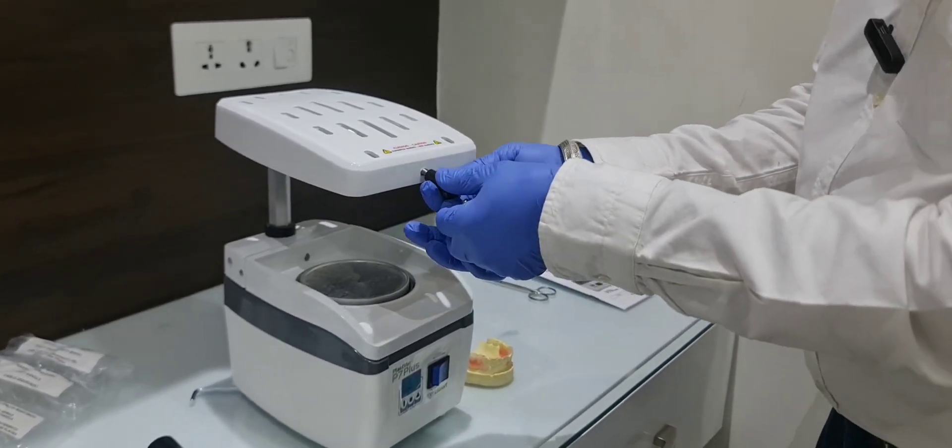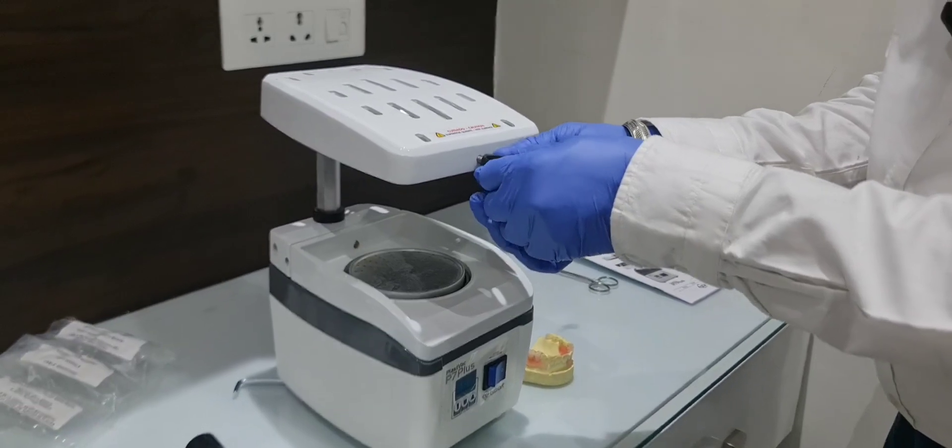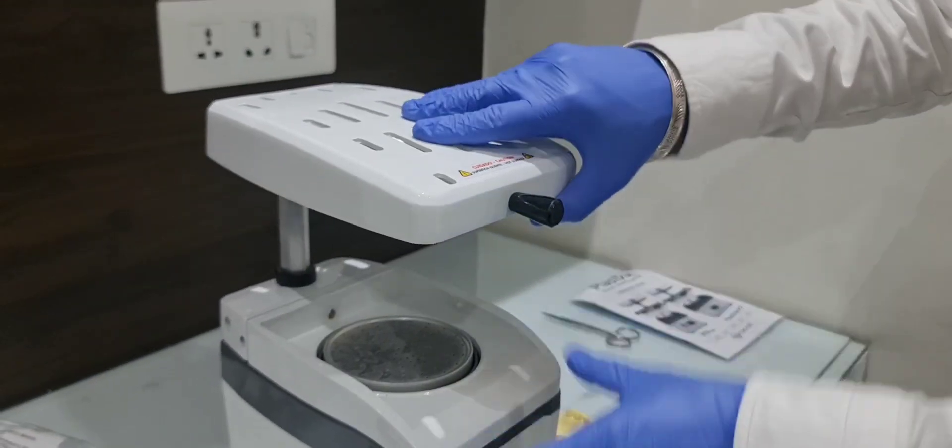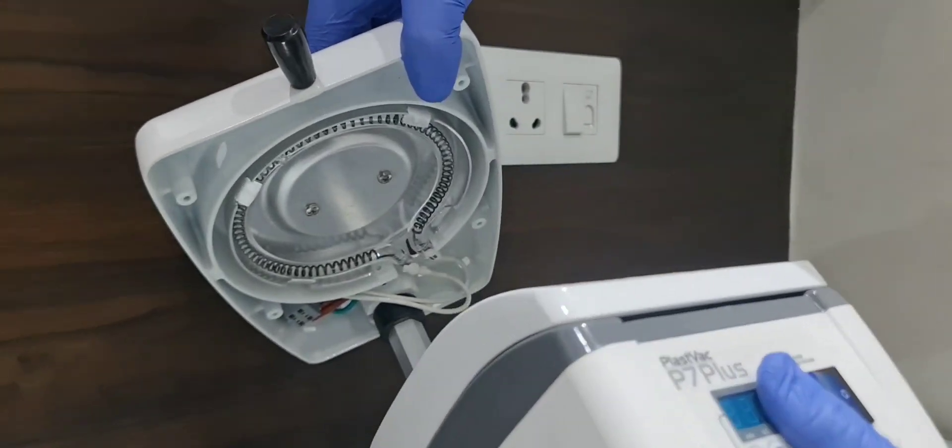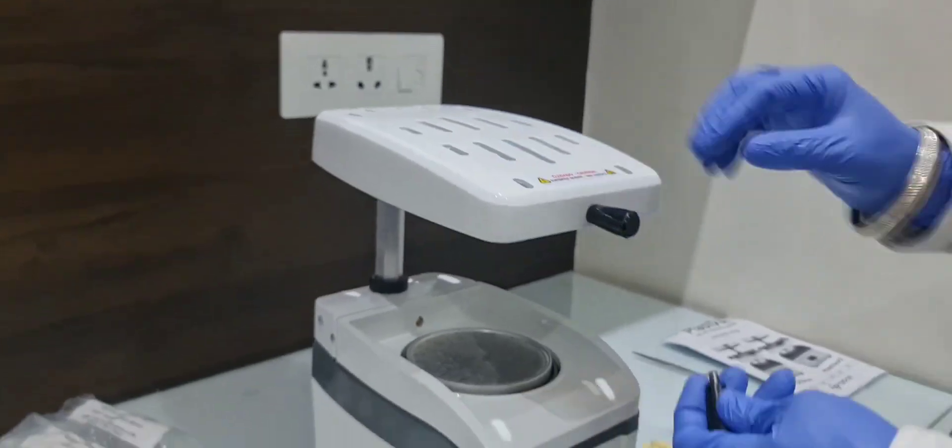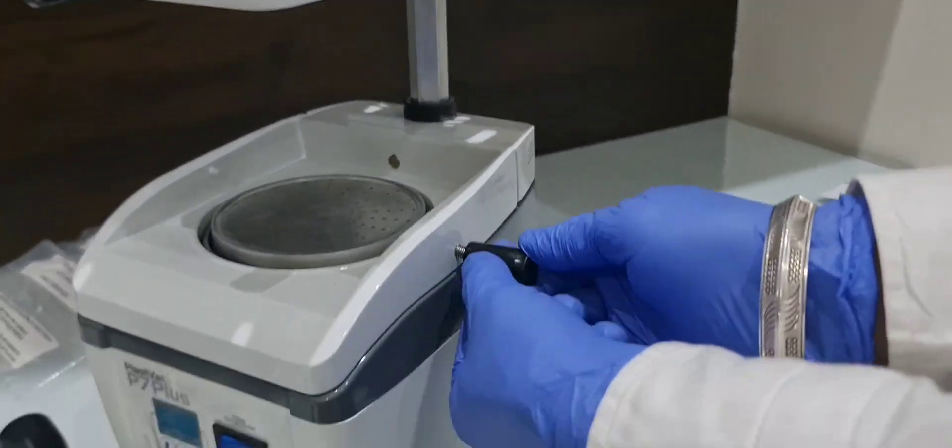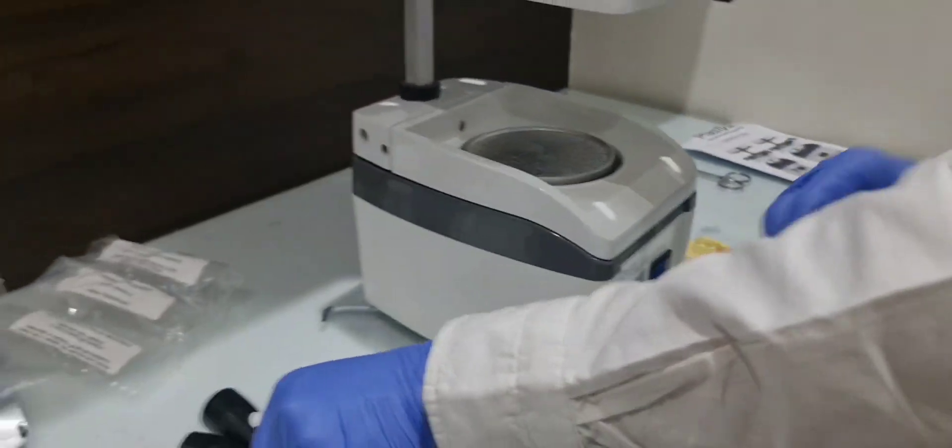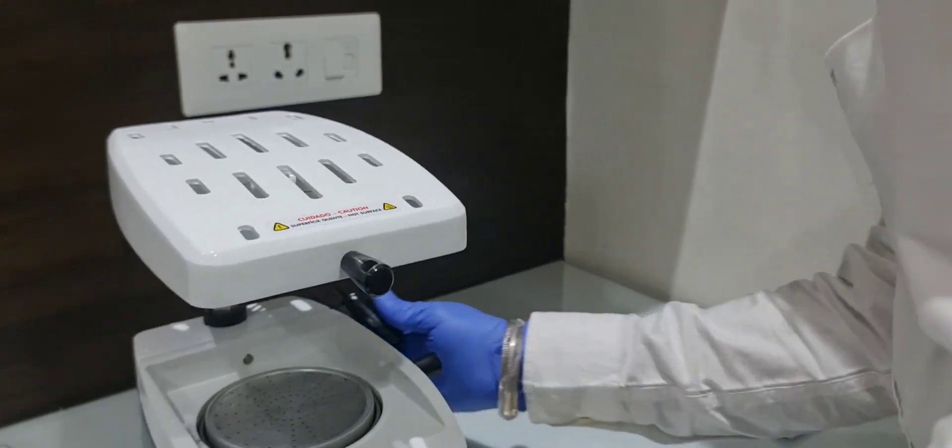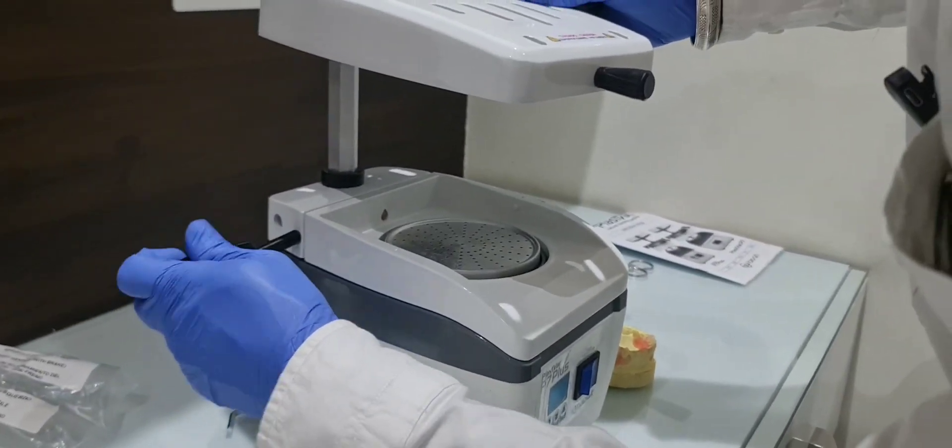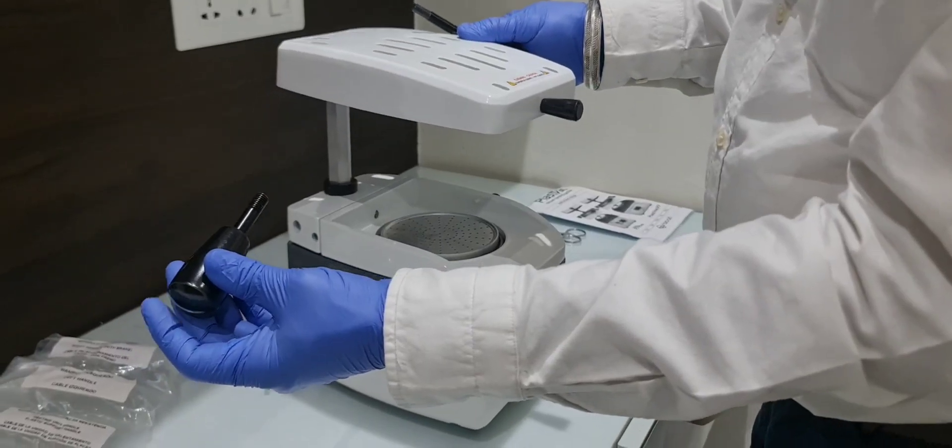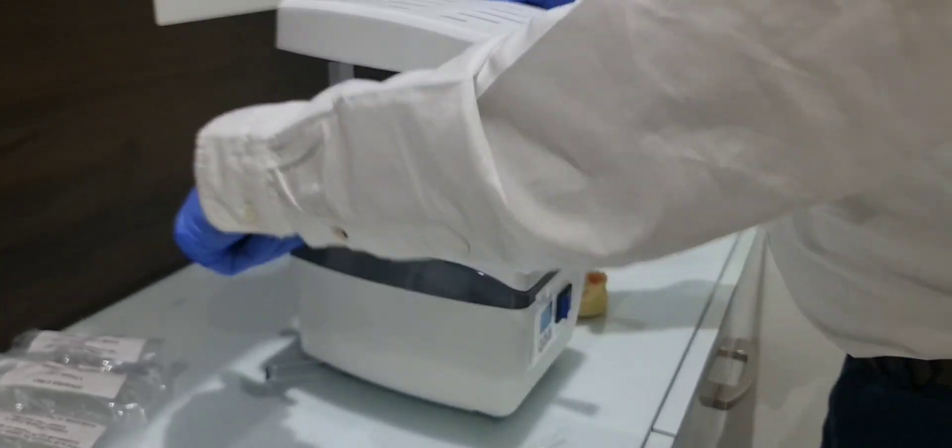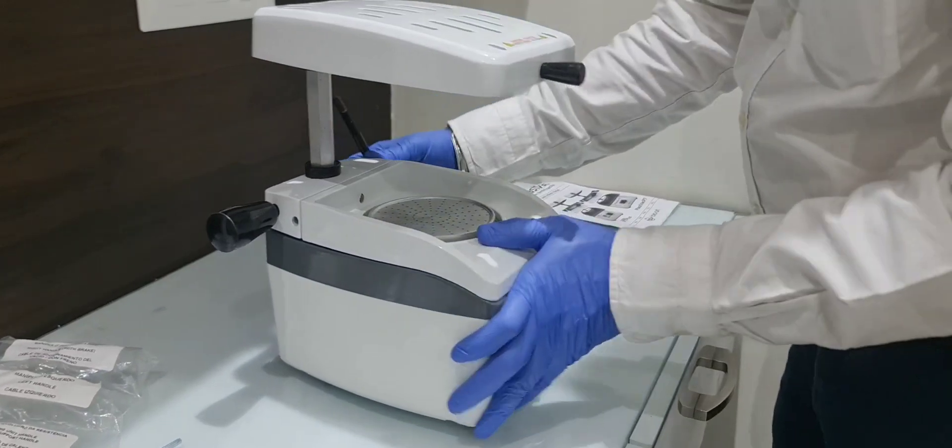These two small handles, one for the movement of the heater, which is inside here you can see. The two bigger ones, the longer one is for the right tray, and this one is for the left.